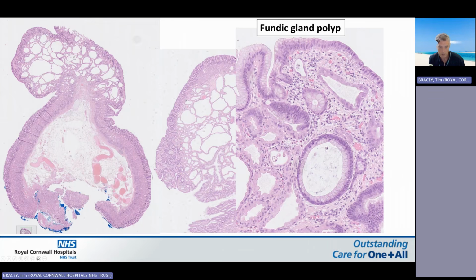I didn't think this was convincing dysplasia because there was no abrupt transition. You can see this is just gradually turning into slightly more hyperchromatic, and actually you can still see that surface mucin vacuole there just retained at the top. And then these are at higher power, these are the oxyntic glands showing what I call PPI related changes.